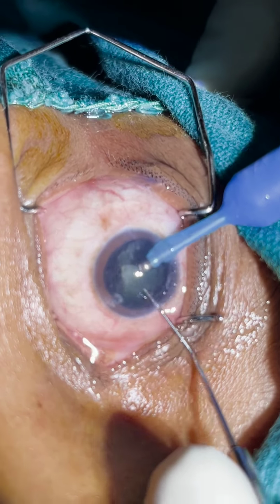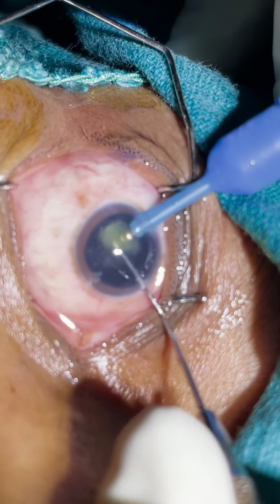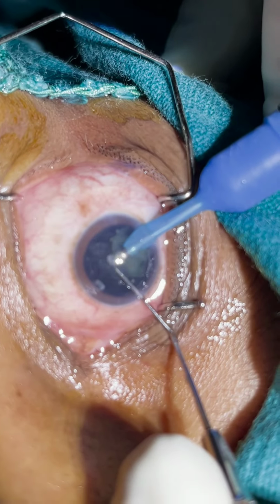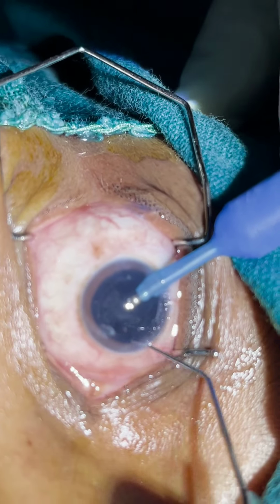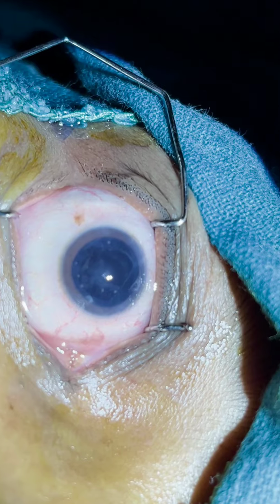Now the last piece, we have to make sure the sharp edge is not directed directly towards the PC, because that may cause a PCR. In the last piece, we also make sure the surge doesn't happen. So this completed the phaco emulsification.